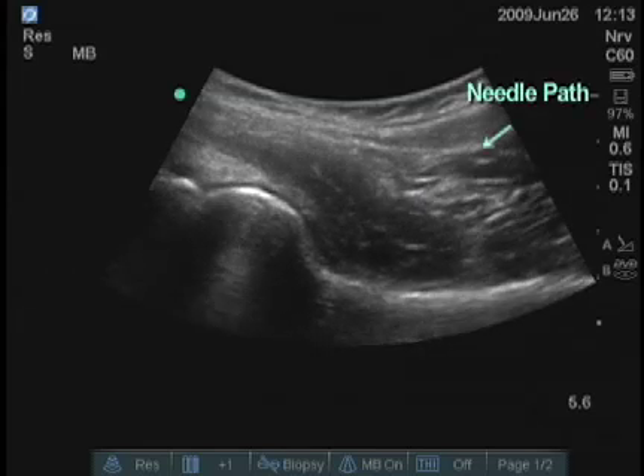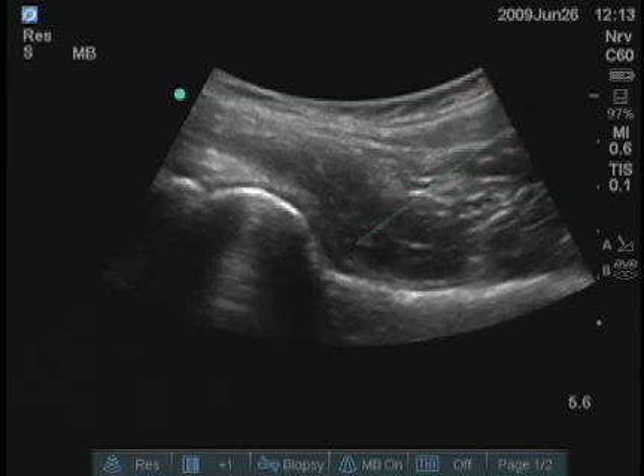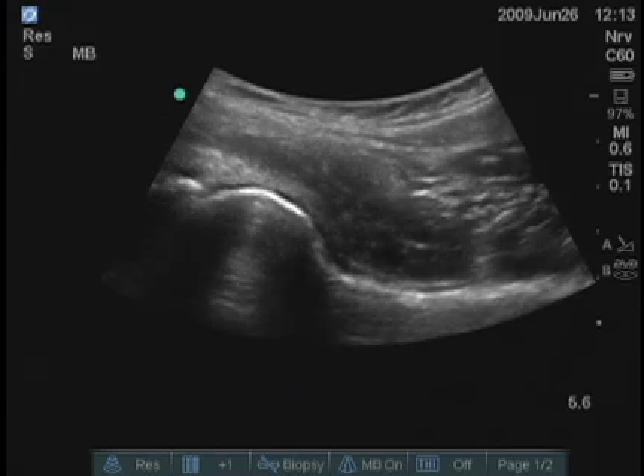You can check the angle of the needle quite quickly once you see the needle coming in on the right top of the screen and adjust the angle and depth accordingly. The goal is to bring the tip of the needle into the V of the neck, and that will be the joint.